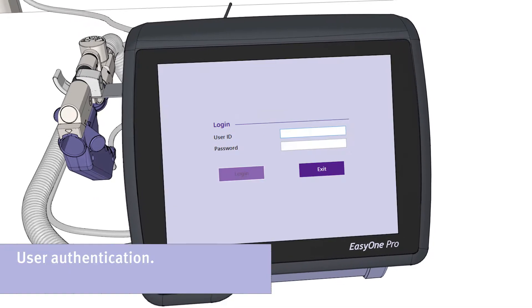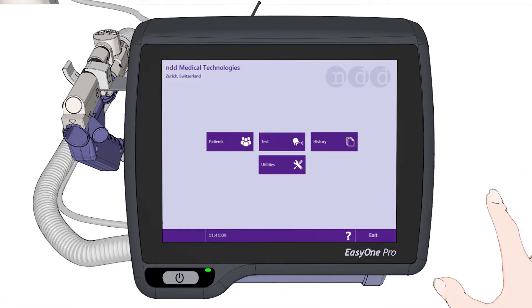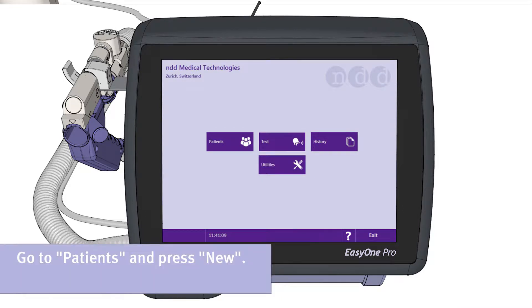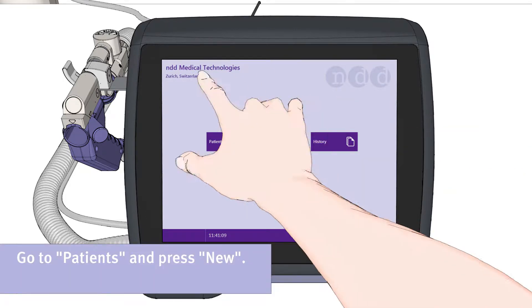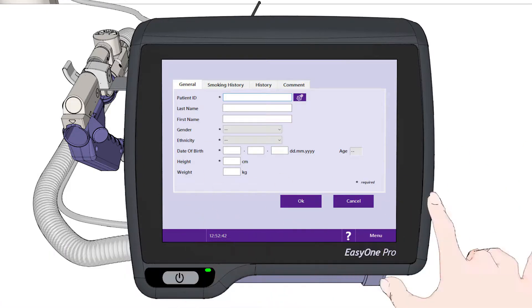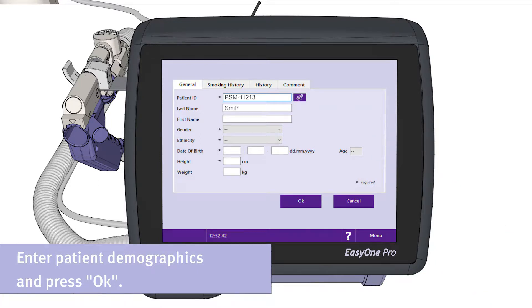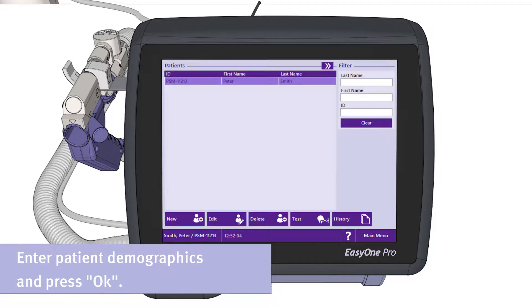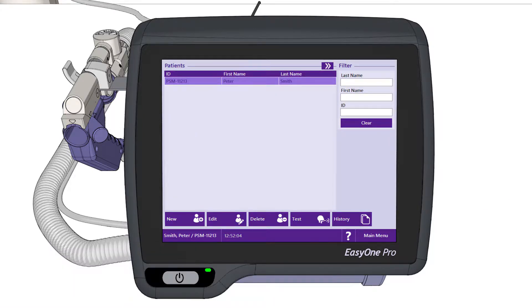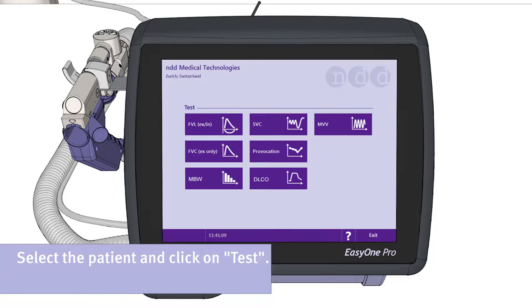Before you can enter the patient data, you need to authenticate yourself as a user. Please click the button Patients, then press New to enter a new patient. Enter the patient demographics and then press OK to save the data. Now select the patient and then click the button Test to select the respective examination you want to perform on the patient.